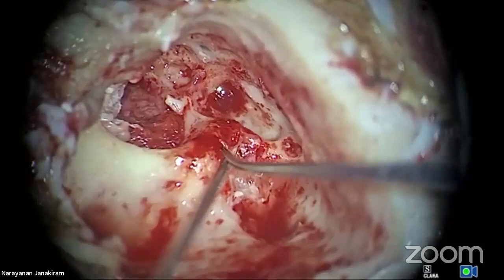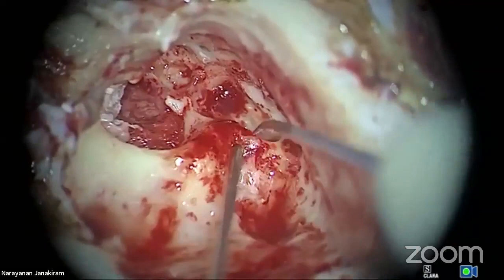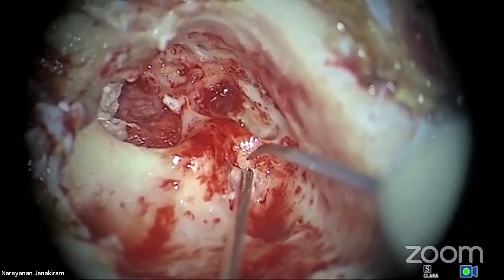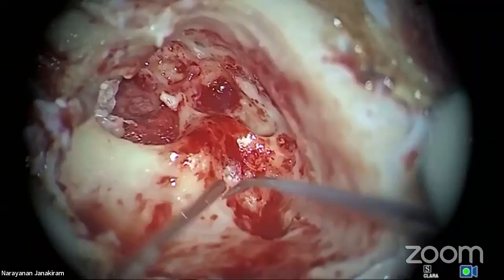See, that's the facial now there. See how I'm doing it now. This is with the hockey stick, everything done with the hockey stick. To me, I think this is a magic instrument. This is cholesteatoma. Can you see how I'm removing it, please? This is called the principle of traction and counter-traction. Good. So that is the last I will remove. Whenever I do semicircular canal dissections, just the suction is doing the work.